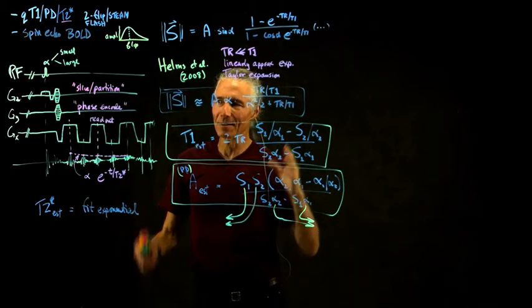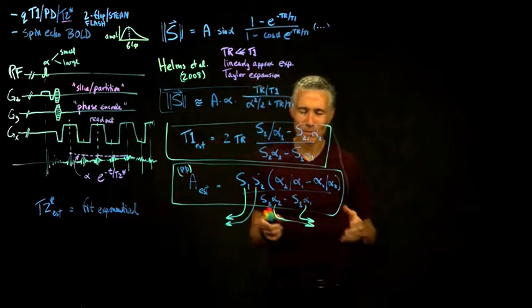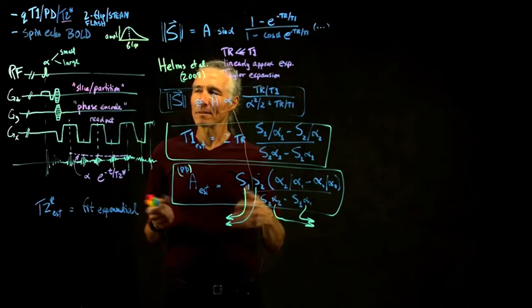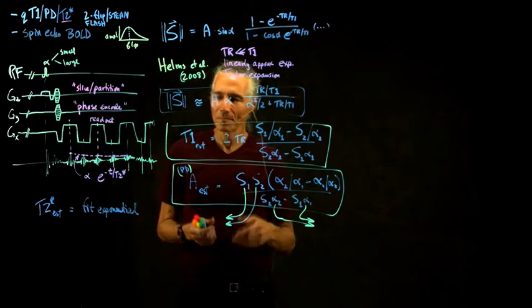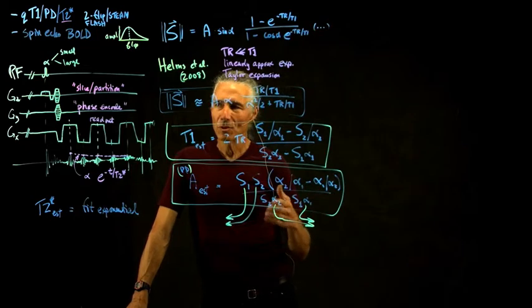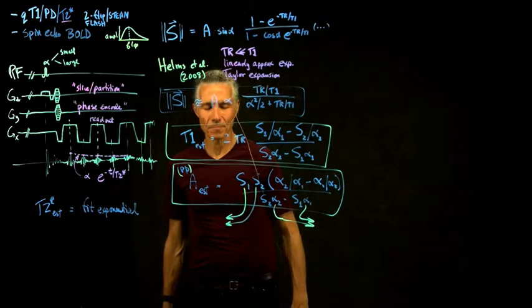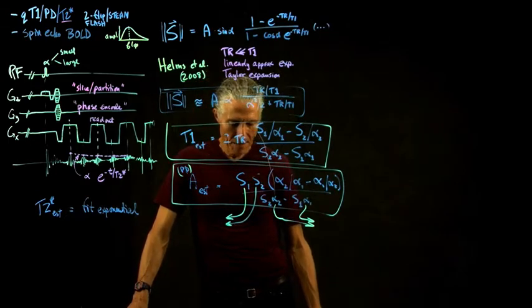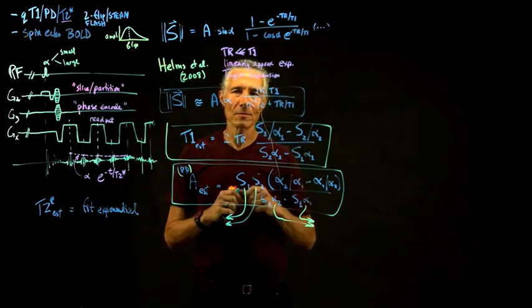Not very hot. The frequency is a lot lower than a microwave. A microwave is 2.4 gigahertz, or 2,400 megahertz. Our frequency is only 123 megahertz. So it's not as hot, but it's a little non-uniform, down maybe about 25%.